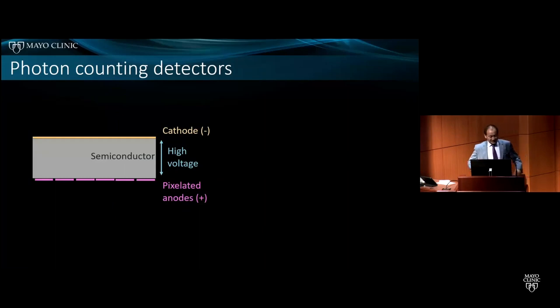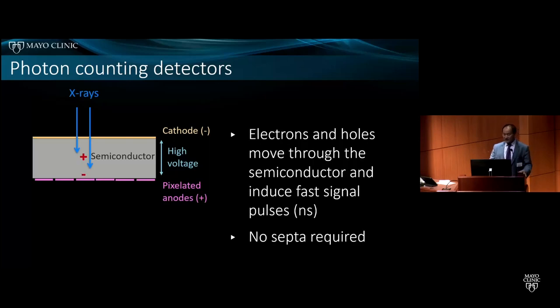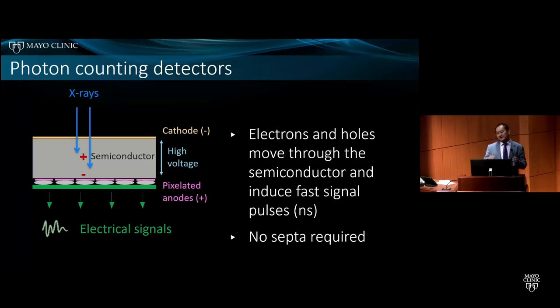Photon counting detectors work a little bit differently. Most of the time in CT, we're talking about photon counting detectors with semiconductors. It's a direct conversion technique: the X-ray interacts with a semiconductor and generates electron-hole pairs. With a bias voltage, the electrons and holes travel and induce an electrical signal. The most important part is that the signal in the photon counting detector is proportional to the energy of individual photons. This time we count individual photons instead of putting them all together into one bucket.